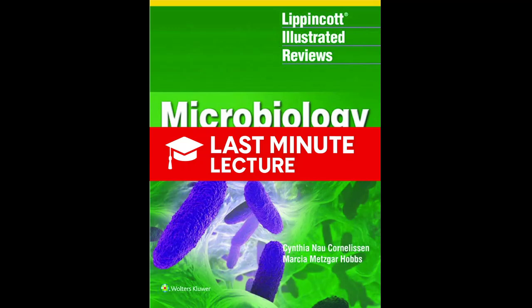It seems like these days it's more automated, though. Oh, for sure. We use systems like the VITEK. It's like a little credit card with dozens of tiny wells, each with a different chemical test. You inoculate it, a machine reads all the color changes, and it compares that pattern to a huge database. It finds a fingerprint match? Precisely. It'll spit out a result like 99.8% probability of Klebsiella pneumoniae. It's incredibly accurate. So identification is sorted.